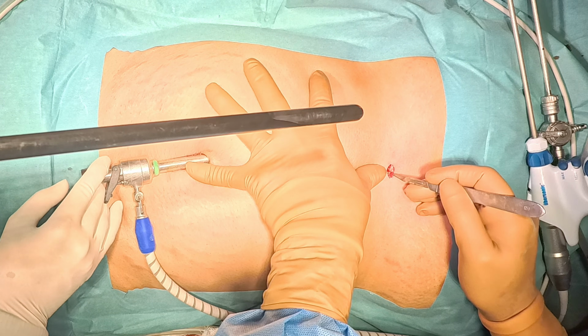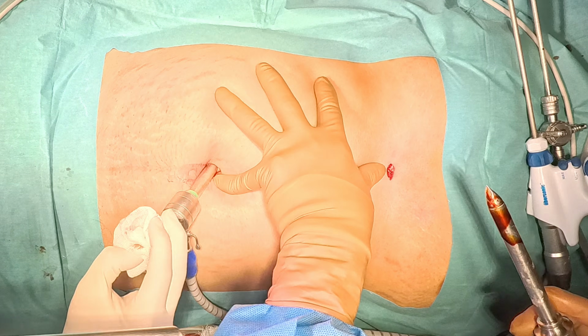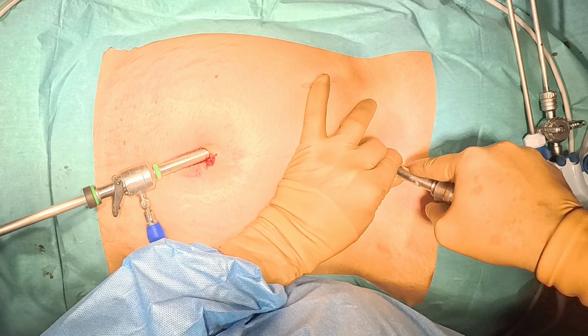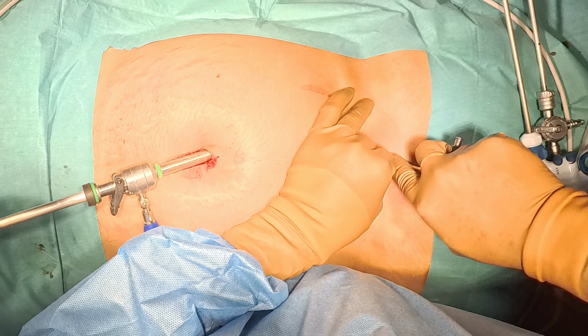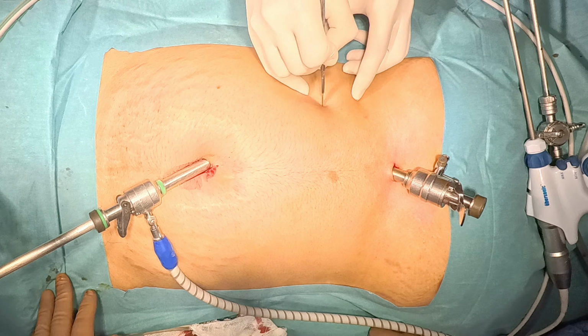Through this port we will put the harmonic, or you can use a hook also, and this should go initially perpendicular and then it will puncture the membranous part of the falciform. So, it will go towards the right. And now this is the second port.